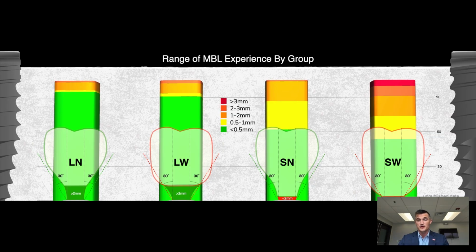And that's important for 2 reasons. One, it shows us the different ranges that we can experience. It shows us that we're being more protective of our implants if we have a longer abutment. But even more so for me, this is a reminder that in clinic, biology is not going to respond with a 100% rate of anything, right?